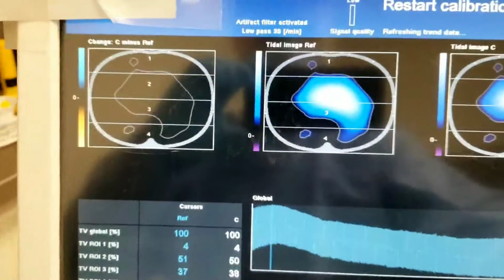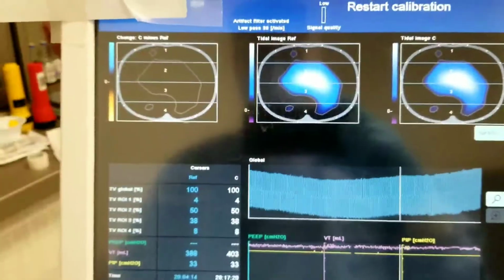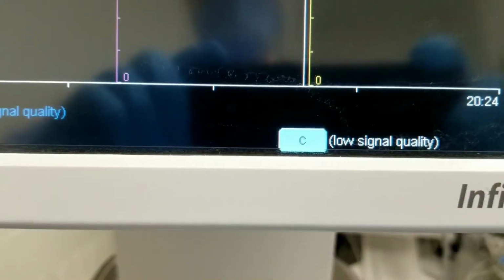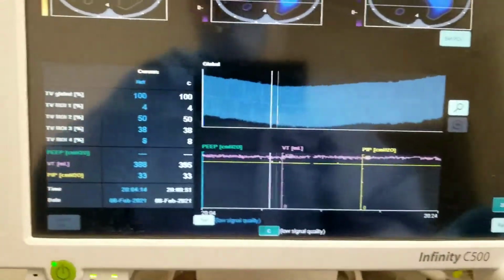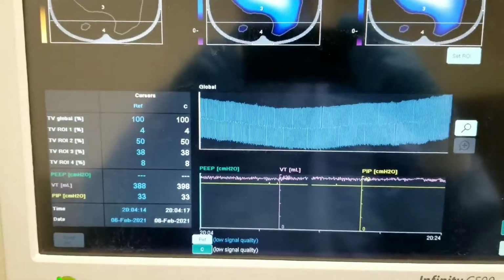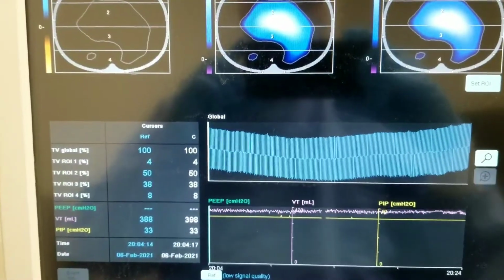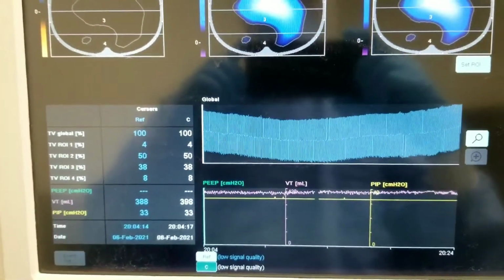Now, this screen here is End Inspiratory Trends. What we do here is we can control 2 aspects: we can control the reference, and then we can set the control. So I did the reduction, and usually without the Pulmovista, what we're dealing with is, okay, we reduced the Phigh, and let's hope the SAT doesn't go down. If the SAT goes down, then usually we would increase it.